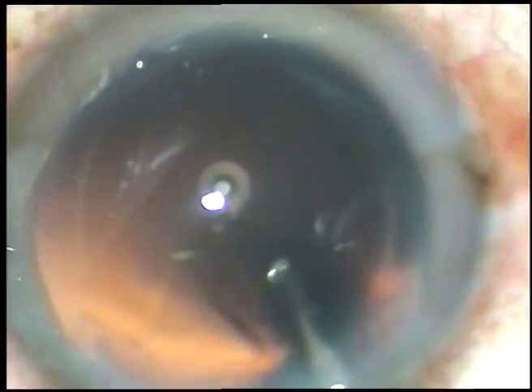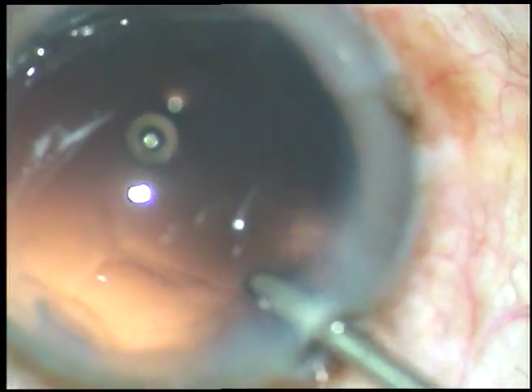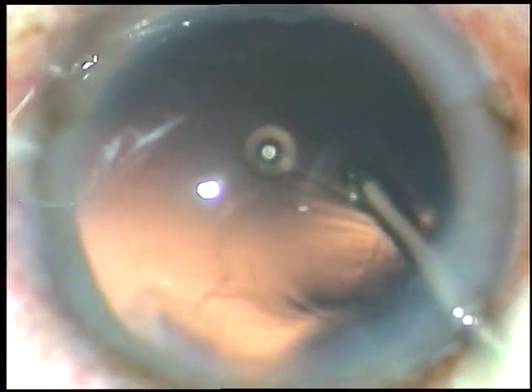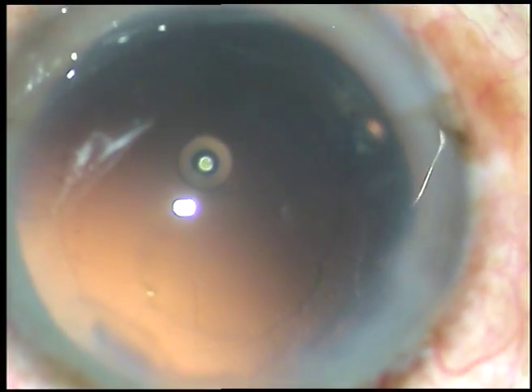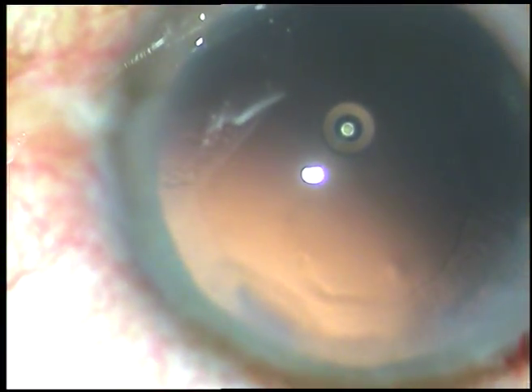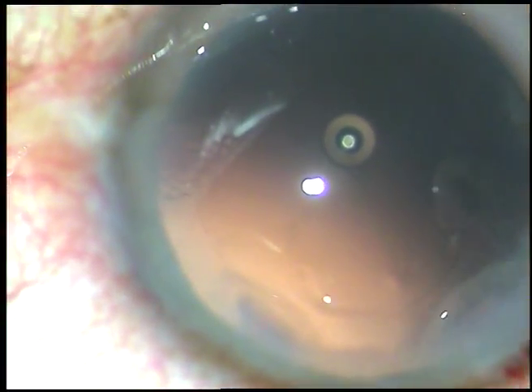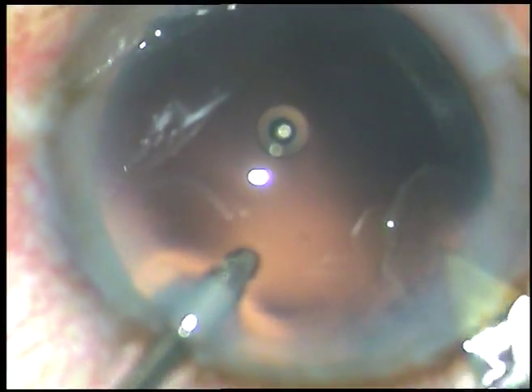Now this is hydropolish. I am using the fluid jet to polish the posterior capsule. You can use cap-bag mode — the capsular polish mode where the vacuum is 10 to 20 mmHg and flow rate is 15 to 20 ml per minute. Even with those low settings I have made a posterior capsular rent in some cases.